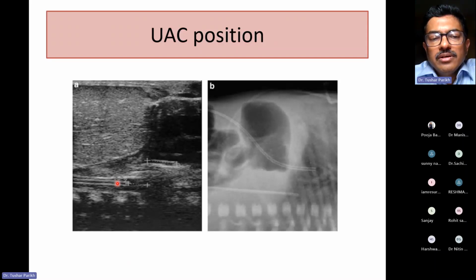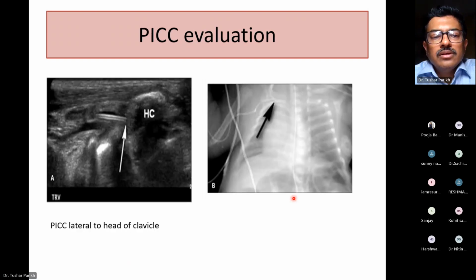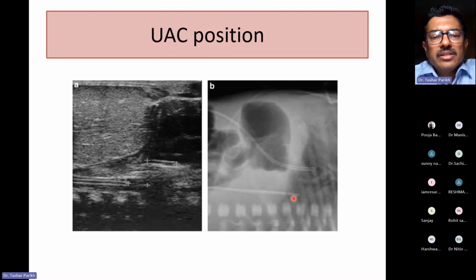And as you're putting the line, that time it is better visualized. To improve the visualization, you can inject some saline, and some people do agitated saline so that you mix it with little air and inject. But again, we don't recommend that. I think saline itself is good enough. And then you can assess the tip position. So again, you have to see as compared to diaphragm, you have to kind of put the position of the tube, and it should be little above the attachment of the diaphragm, basically.